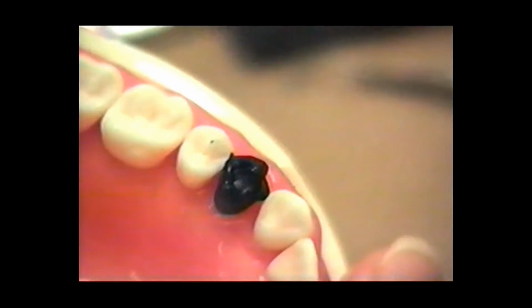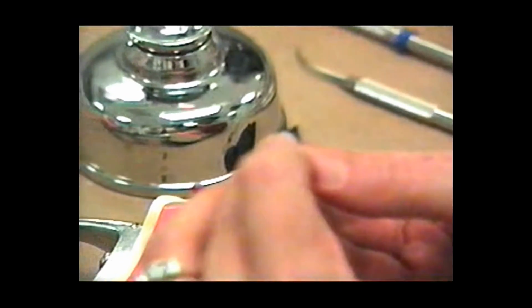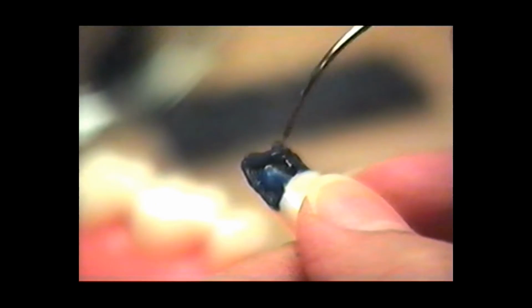Now can you see it's starting to look more like a tooth, right? But I'll show you that it's not anywhere near done, but it's close. We've got a contact that's got a little rub mark in there. You won't be able to see that maybe real well. But we need to fill in now all these contours down here. But look at this. We know that we've got to fill in enough wax to come to the edge of the tooth from your contact area. So we can just do that.